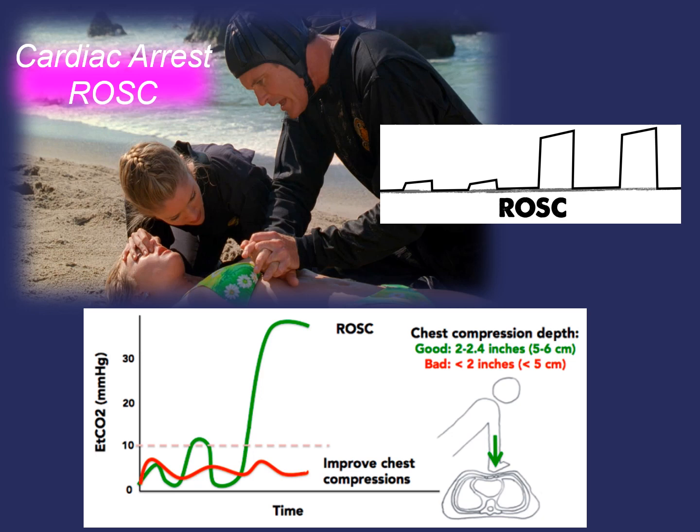This is often the first sign seen when ROSC has occurred, even before a palpable carotid pulse. Now, when this sudden increase is seen, this doesn't mean we stop compressions. We need to continue our chest compressions and ventilations until the next pulse check. And when we do check for that pulse, you can feel a pulse.